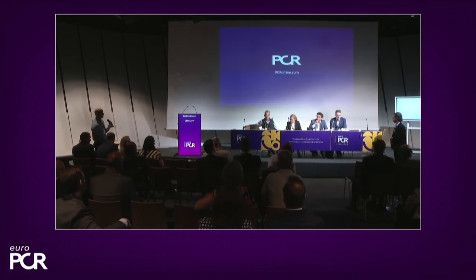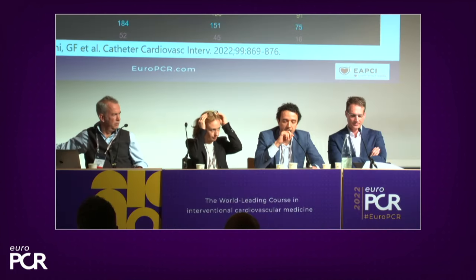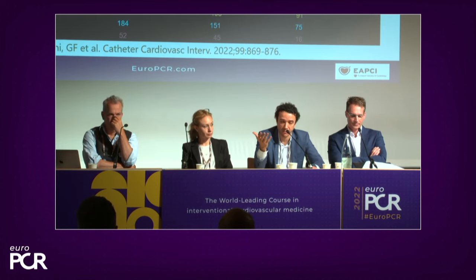I believe that both are possible, right? We don't have the right answer for this question, as you know. That's the data that we published. This is TVT data, and I want everybody to have full disclosure: these are very highly selected patients, the patients in whom the operators thought that the anatomy was very favorable for TAVI-in-TAVI. So just keep this in mind.